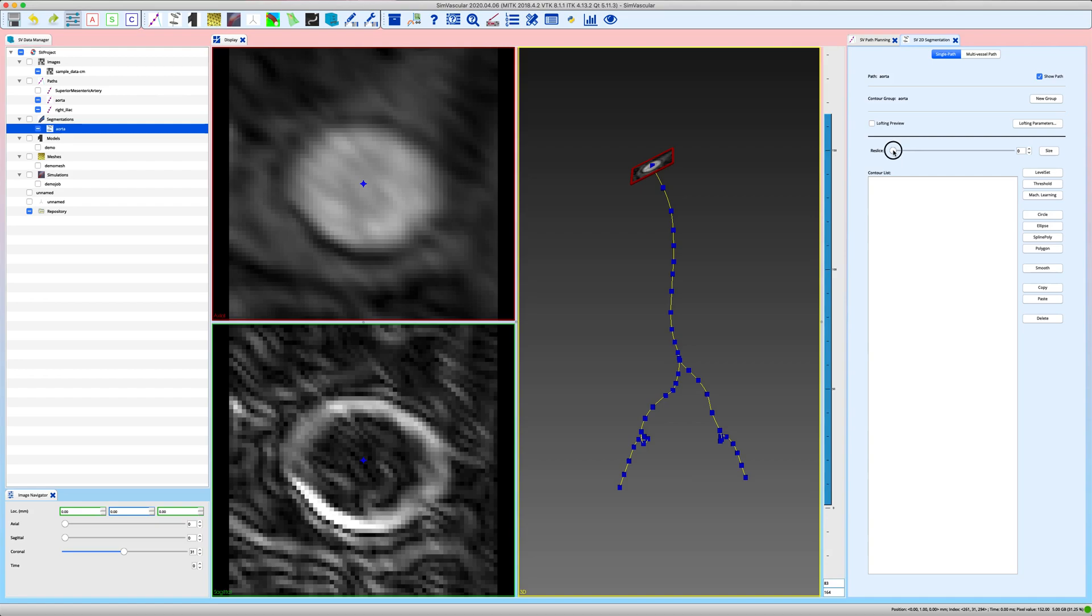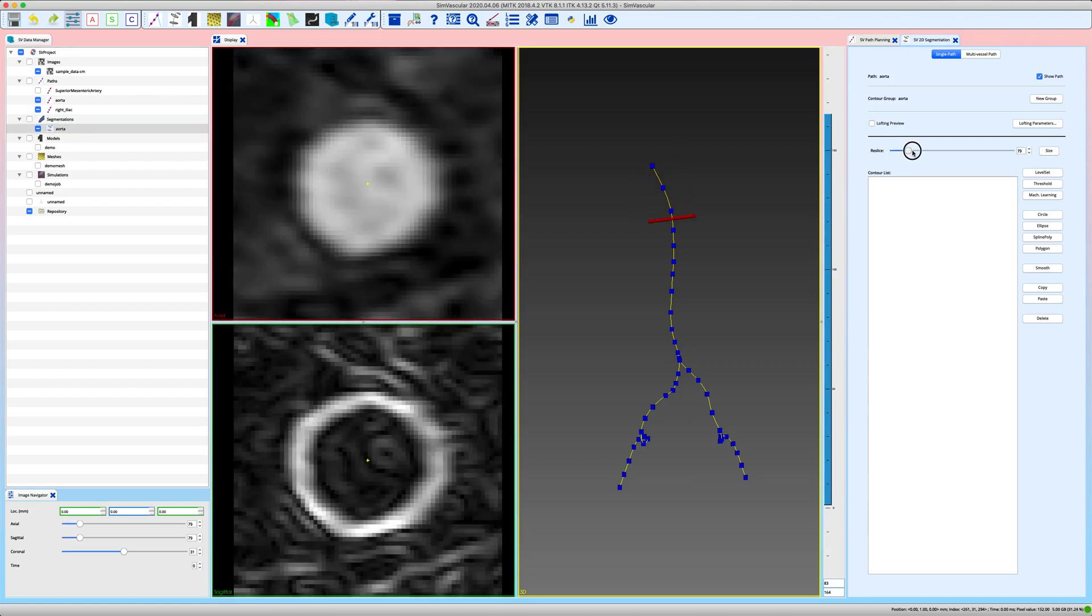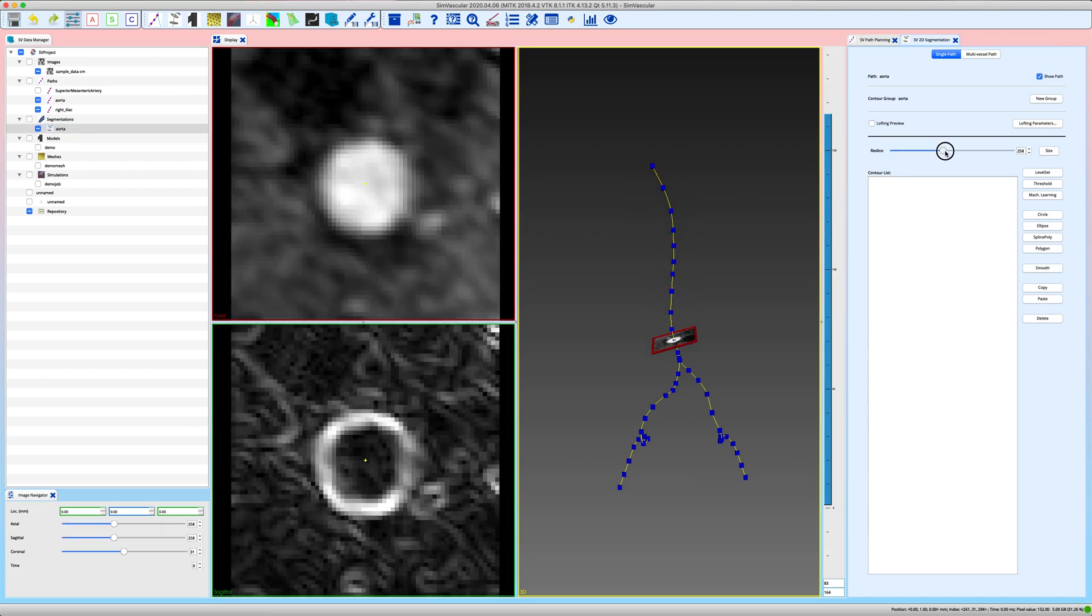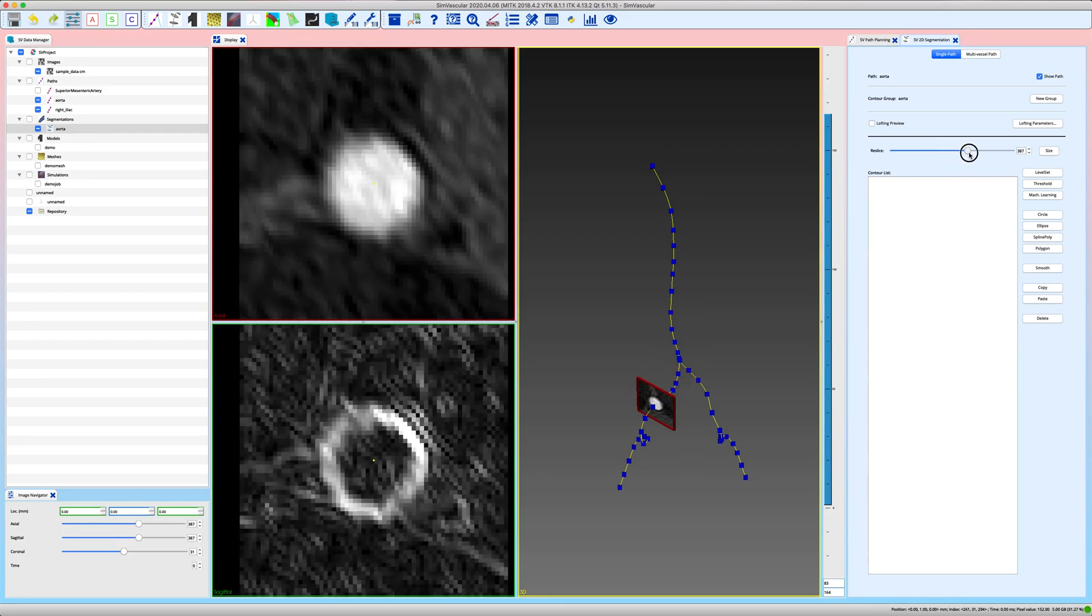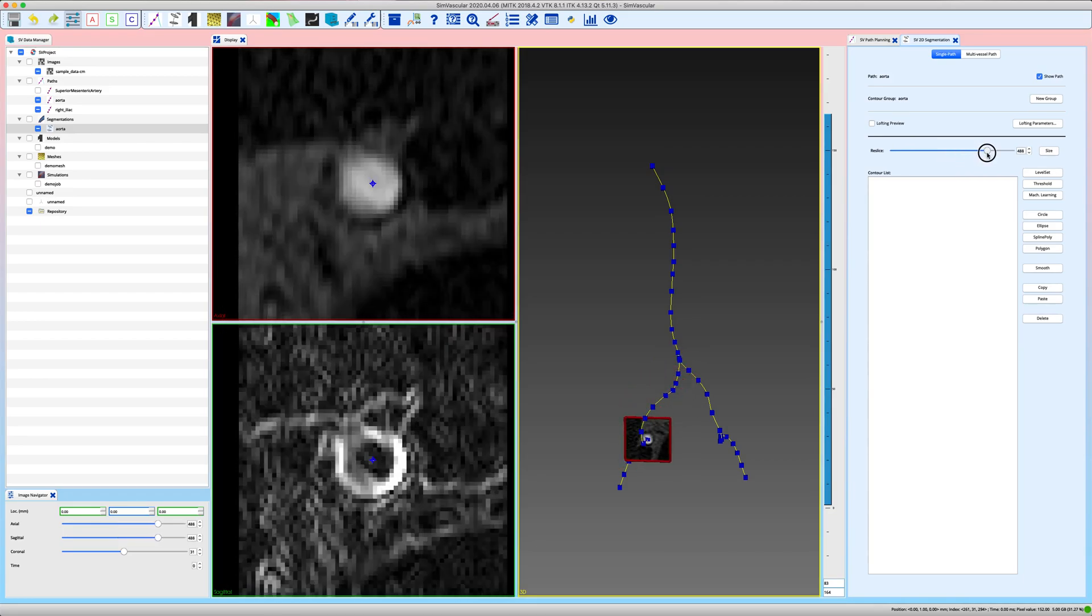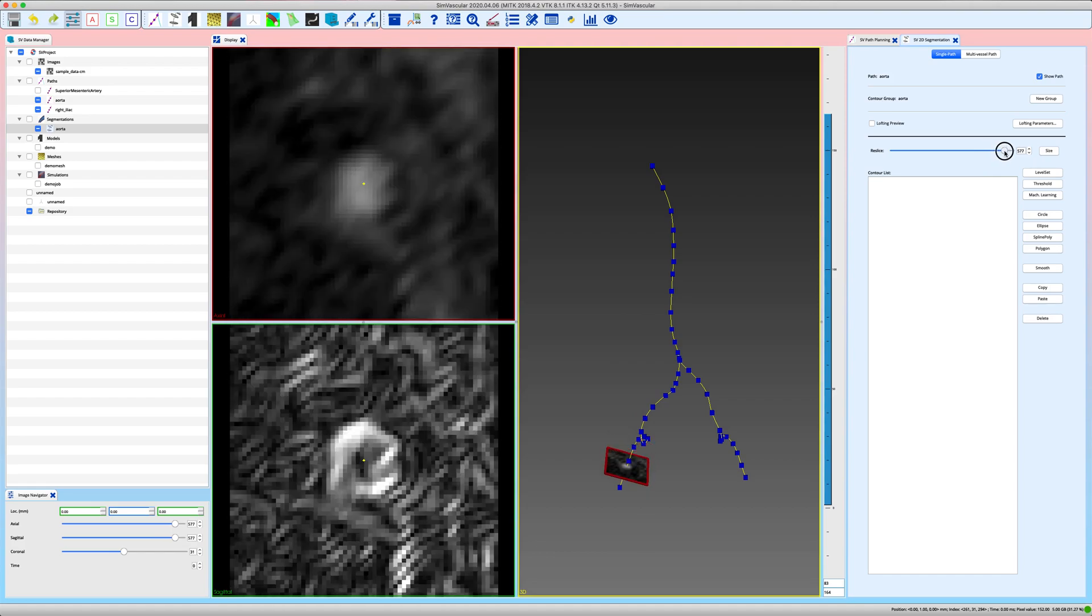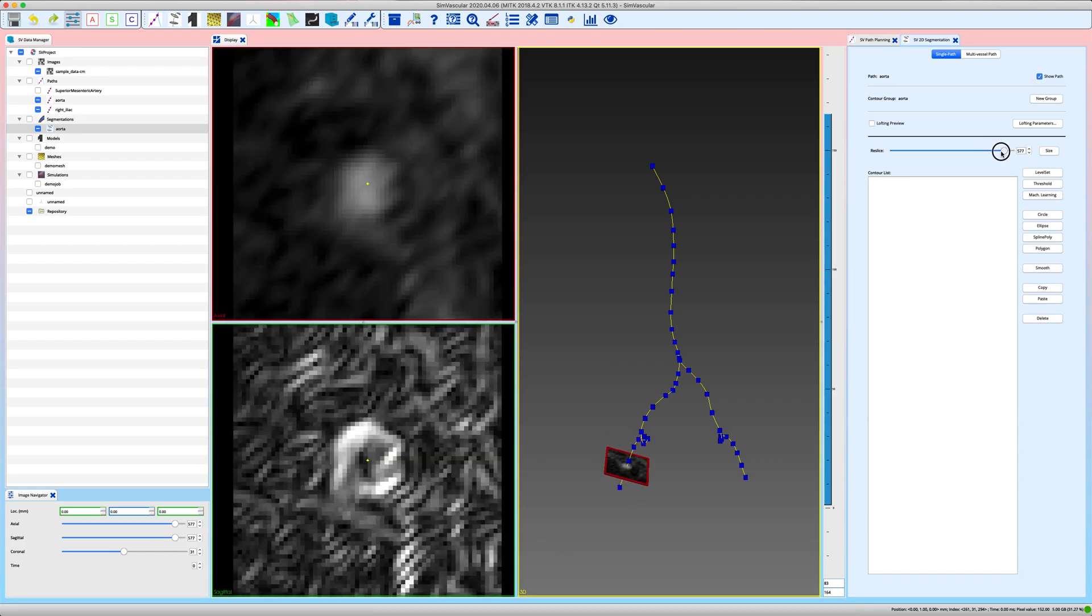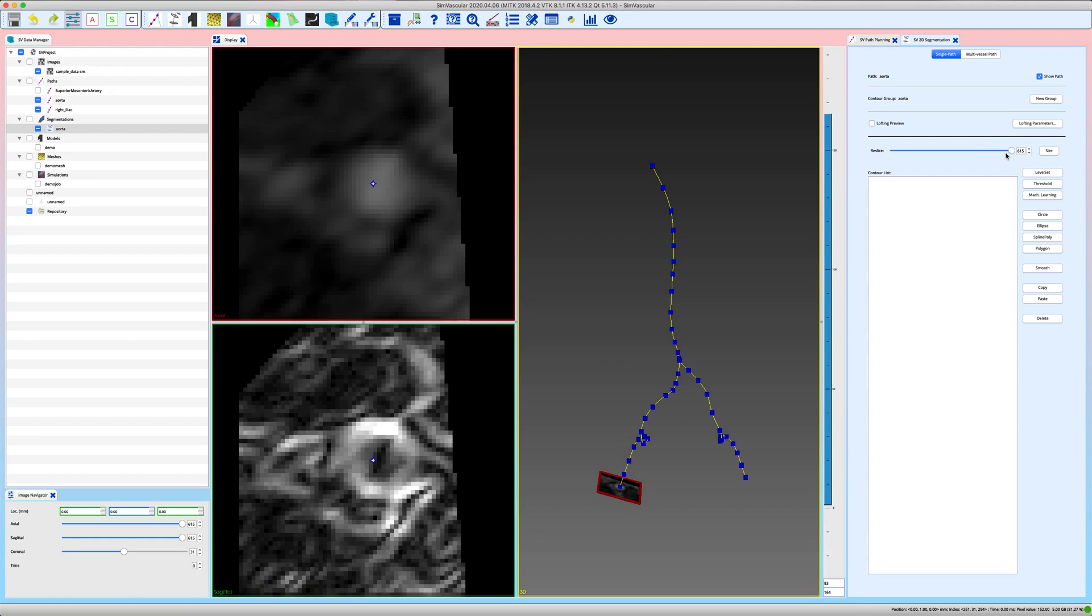And this plane will move perpendicular to your path line, and reslice your image data perpendicular to the path line along all the, for this case 615 reslice planes.